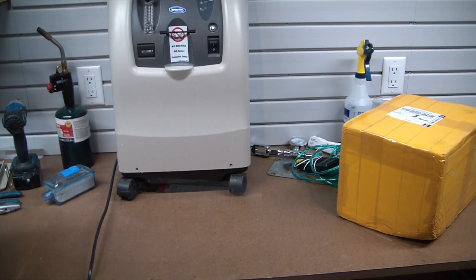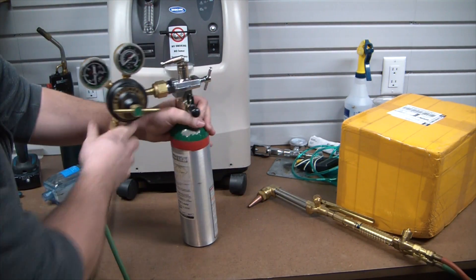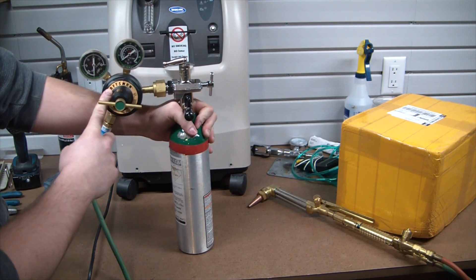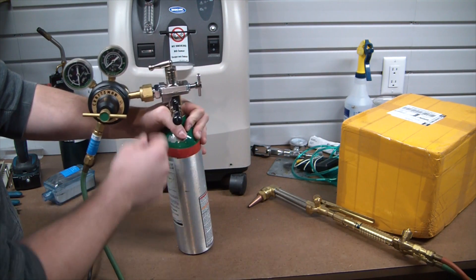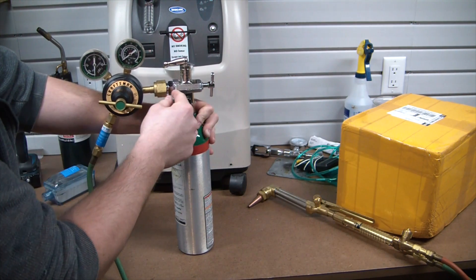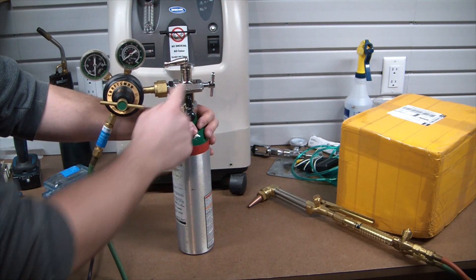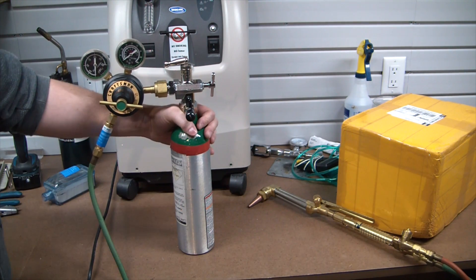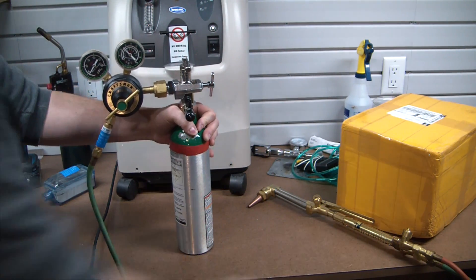Now, you can't just directly plug a welding regulator — which uses a CGA 540 fitting — into a medical oxygen bottle. Medical oxygen bottles use a CGA 870 connection. I found this awesome little adapter on eBay for about $29 that screws right on and goes from CGA 870 to CGA 540, so you can screw on your welding oxygen regulator and get pressure from it.